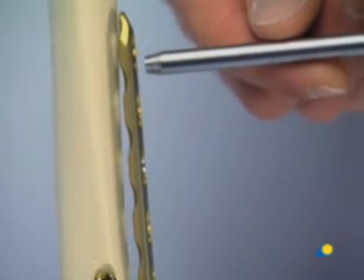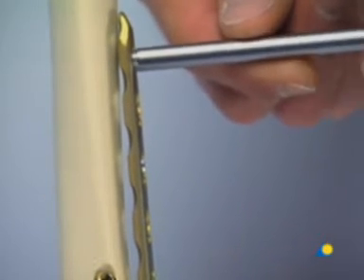To make sure that the sleeve has been placed correctly, its purchase in the screw hole has to be checked. Here, it is moved sideways, which means that it has to be reinserted. Once the thread has found a firm hold in the plate, the sleeve will not move.